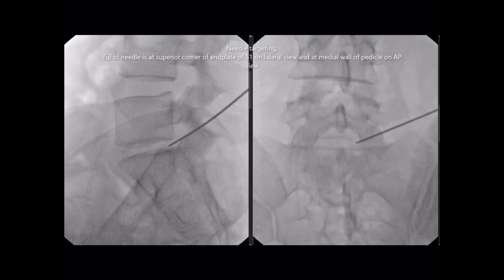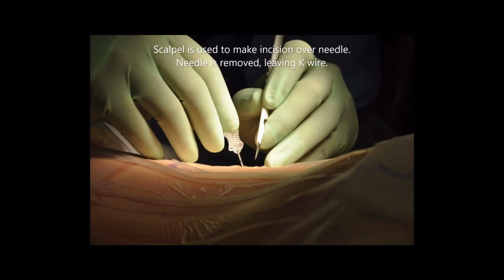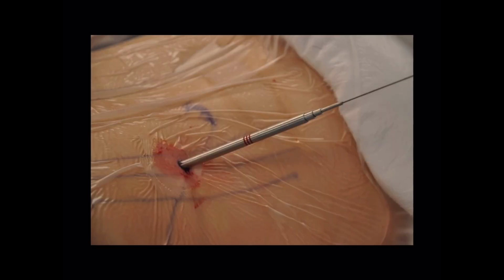Next we'll look at the approach at the time of surgery using a needle to target the corner of the end plate of S1 laterally and the medial wall of the pedicle on AP view. When we have the approach planned, we advance an 18-gauge spinal needle with a K-wire, continue to take images to confirm location. Scalpel is then used to create a small incision over the needle.